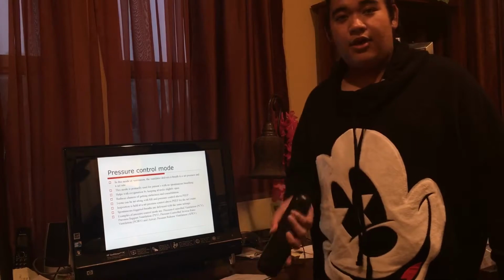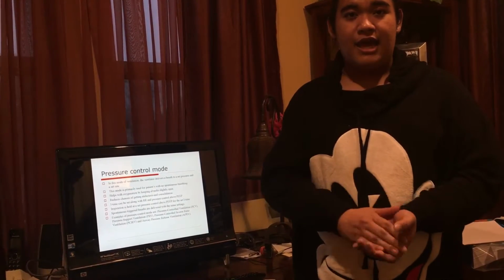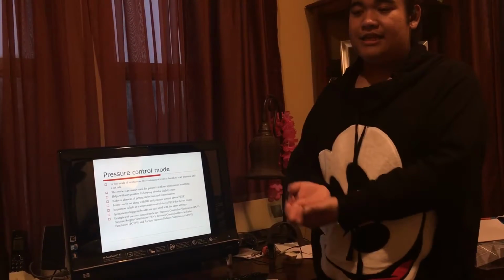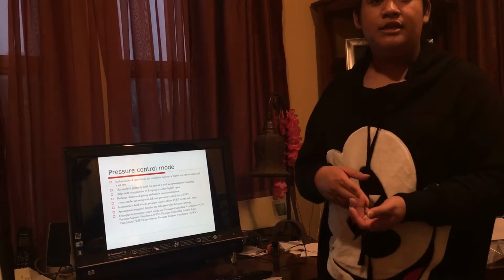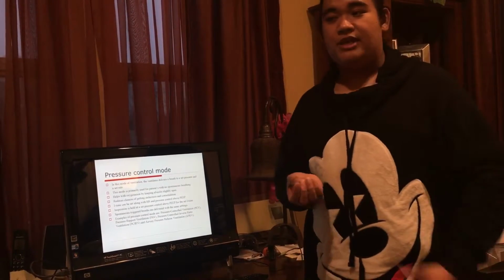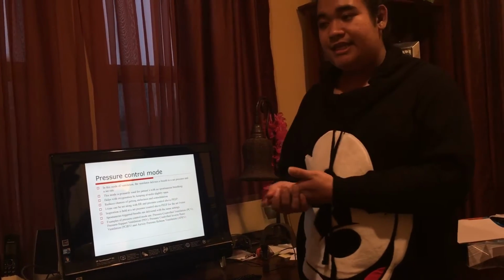Okay, so when the patient is sedated and they're getting these settings, like let's say a pressure of 20, respiratory rate of 15, I time of 1, and PEEP of 5. Let's say those are all the patient's settings right now while they're sedated.